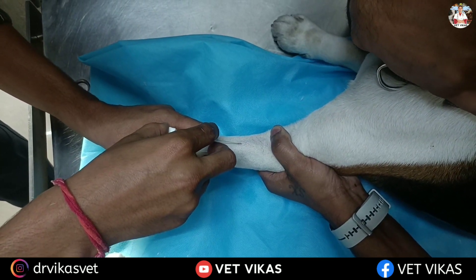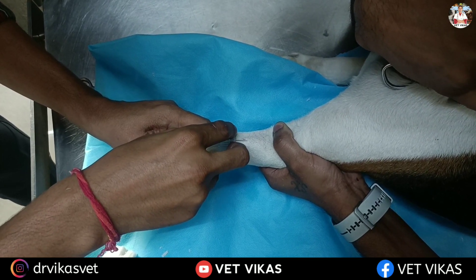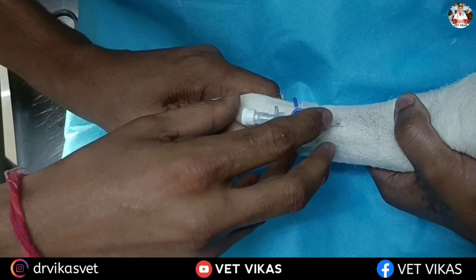Slowly you have to insert the tip at an angle of 30 to 40 degrees. After inserting, you have to see the blood in the flash chamber.